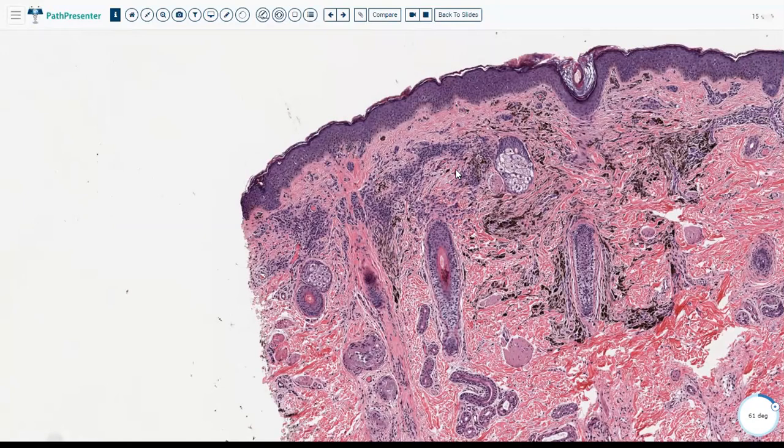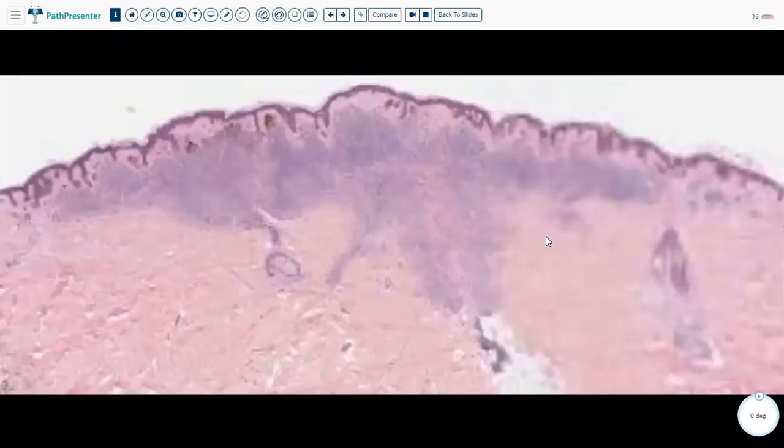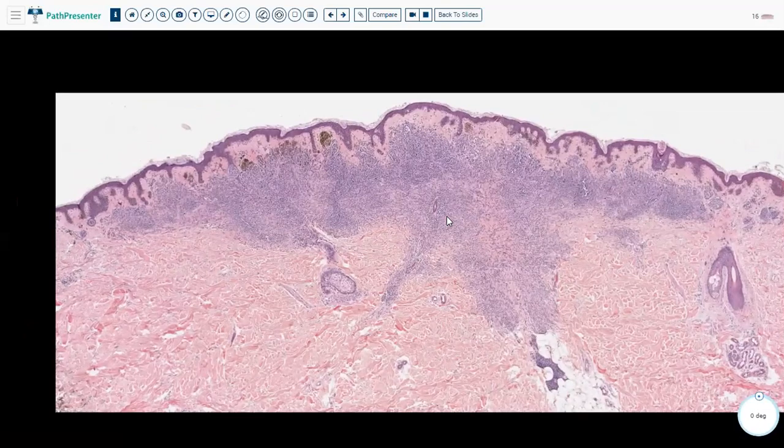Combined nevi can be a mixture. It's most often a mixture of a normal nevus and a blue nevus. Very often there is an epidermal component to the normal nevus. And that's what I told you earlier, that would be the only situation where you would find a blue nevus with an epidermal component. That's when it's part of a combined nevus. But theoretically and practically, we can see a combination of any two types of nevi. Sometimes it's a combination of Spitz and blue nevus. Sometimes it's a combination of Spitz and normal nevus. But most often it's between a nevomelanocytic nevus and a blue nevus. Okay, moving on to the next slide.